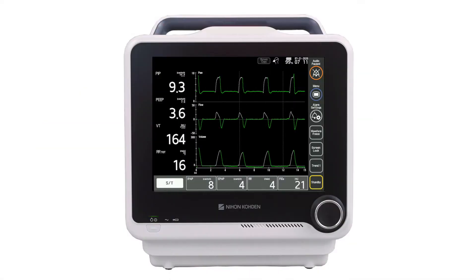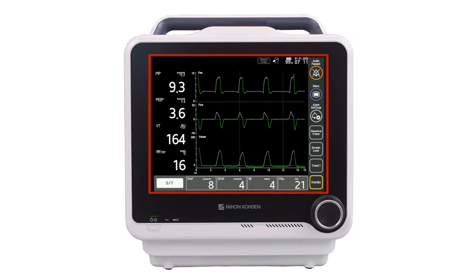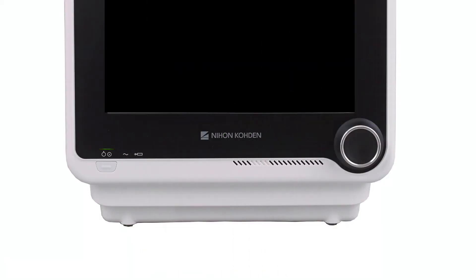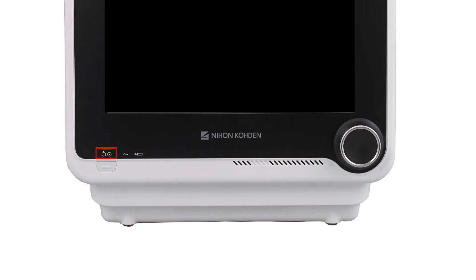On the front of the ventilator is the 12.1 inch graphical user interface, referred to as the GUI. Clinicians interact with the GUI both through the touch interface and the encoder knob. A large alarm indicator provides 360 degree visibility. Below the GUI is the power on/off button, the speaker, and LEDs that indicate power on/off, AC power connected, and battery charging status.